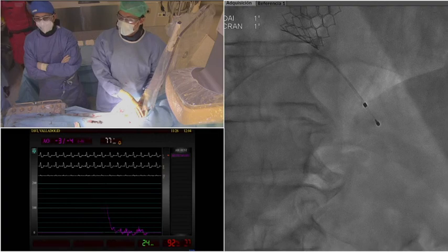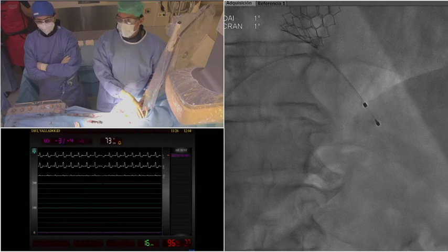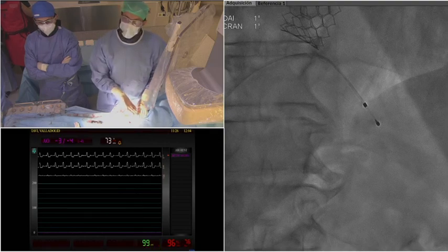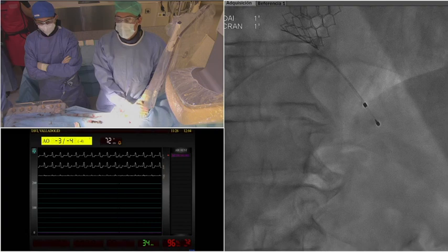For me, there are several differences. First one, the crimp is directly on the balloon, which is important because it's quicker. I mean, if you have to implant rapidly a second valve, this is important. A few seconds can change the outcomes of a patient. Also, you can use a 14 French introducer. For Sapien 3 it is larger, for larger sizes. I think for Sapien Ultra it will be also 14. We will see how this works.